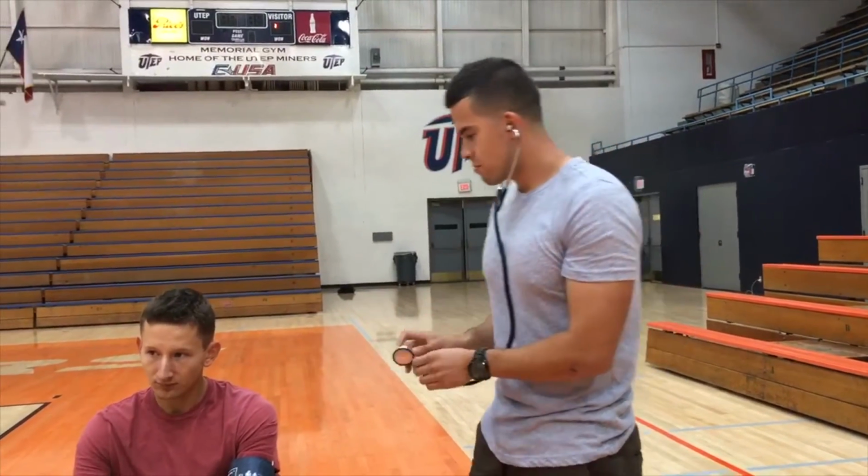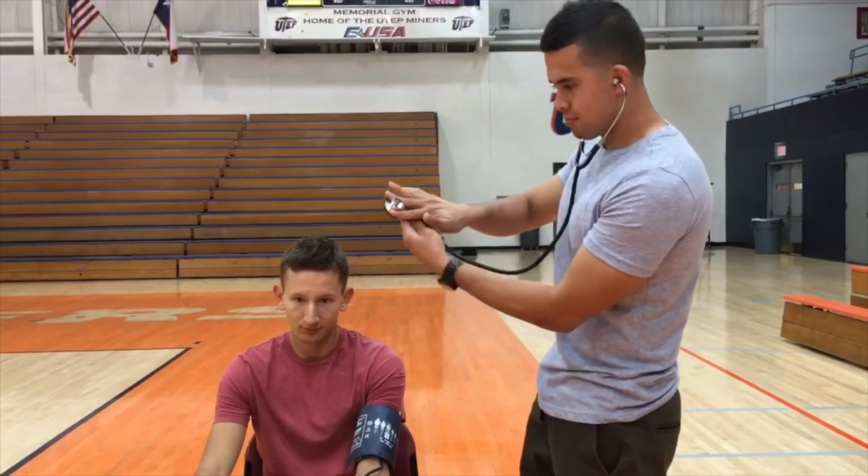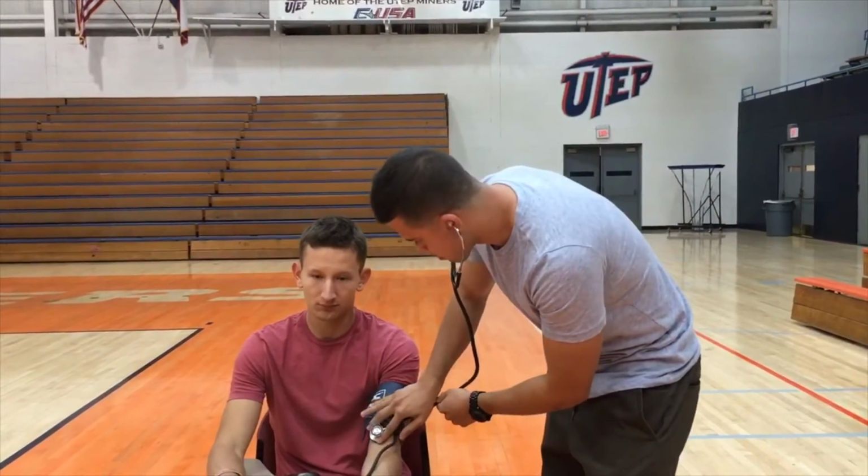We take our index and middle fingers and do not place them on top of the bell, but instead place them on either side of the bell, and placing the bell directly under the cuff over the brachial artery.